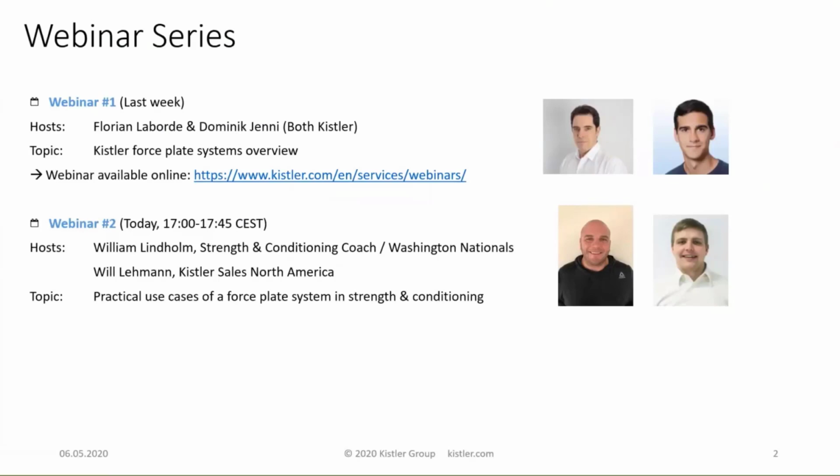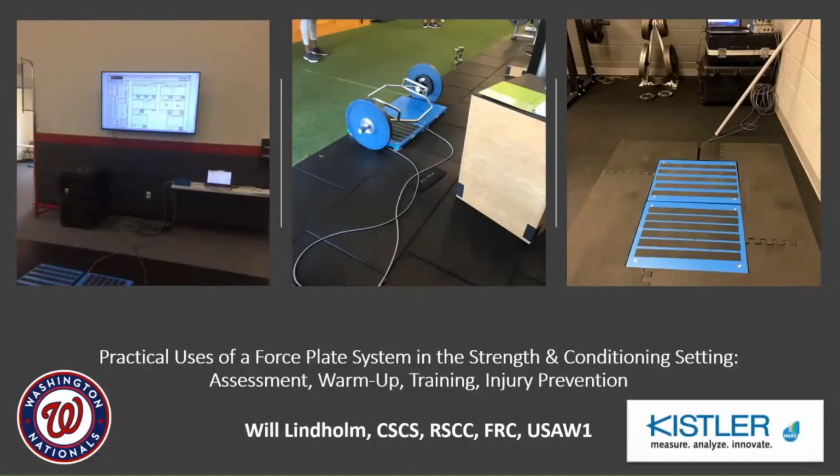So for today's webinar, this is the second in our series. It will be presented by Will Lindholm, who has been working with force plates for the past 6 years, assessing many athletes in a variety of sports in both professional and private training centers. Will describe how he collects athletes' data using Kistler force plates and MARS software, how he interprets the data, and how he then applies that information to his athletes' training program. Hopefully, at the end of this presentation, you'll have a better understanding of how we can use force plates for performance monitoring to optimize your athlete's strength and conditioning program.